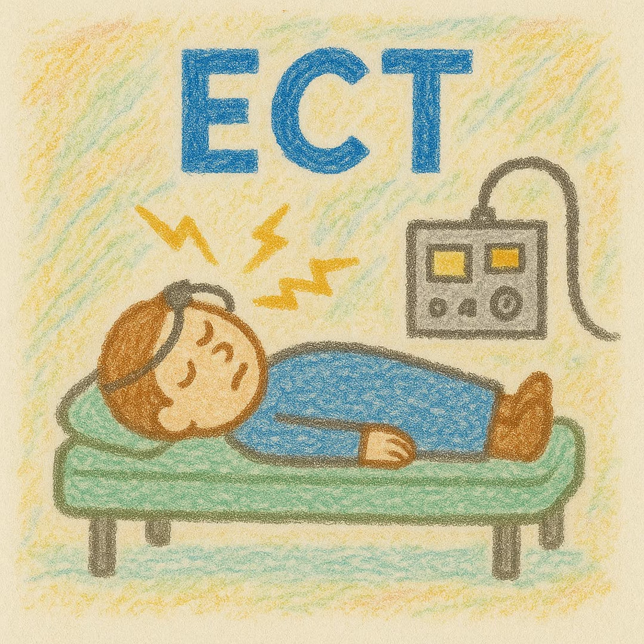electrodes, the stimulus electrodes. So they've already got the recording electrodes, the EEG recording electrodes on their head. Then we will put the stimulus electrodes on. And there's different ways to do this. There are handheld electrodes that you have to hold like paddles, and you place them where you want to place them and then deliver the stimulus that way. There's also kind of stick-on electrodes and other ways to do the stimulus electrodes. But in the end, they're stimulus electrodes.